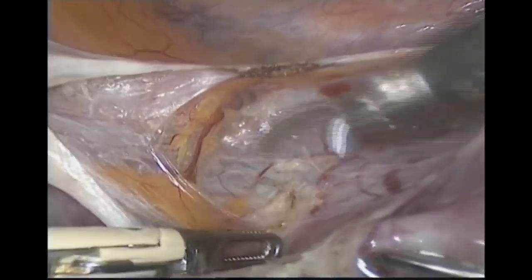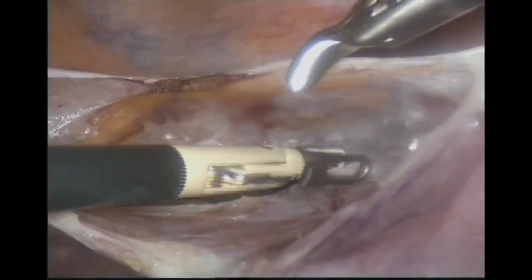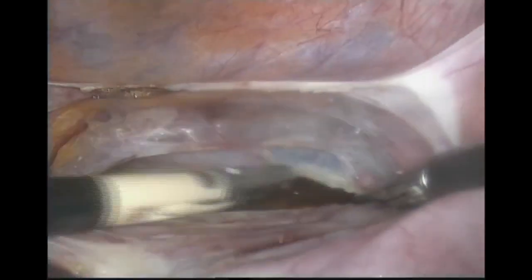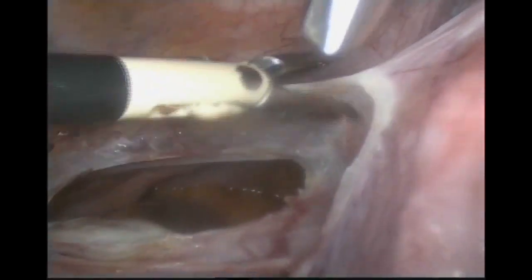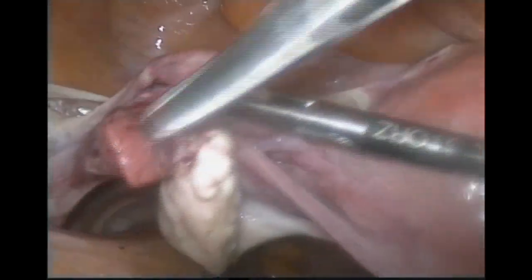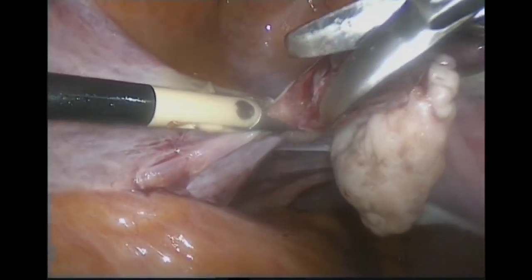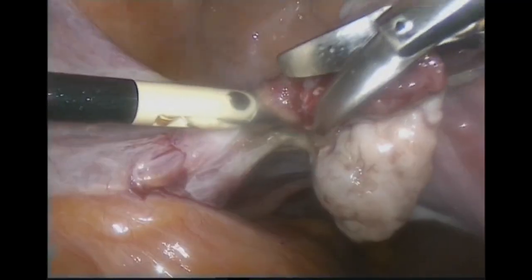Anterior leaf, uterovesical fold: divide the anterior leaf of the broad ligament along the vesico-uterine fold toward the midline. Start your round ligament coag and cut, then go to the second step, which is the upper pedicle of the adnexa.